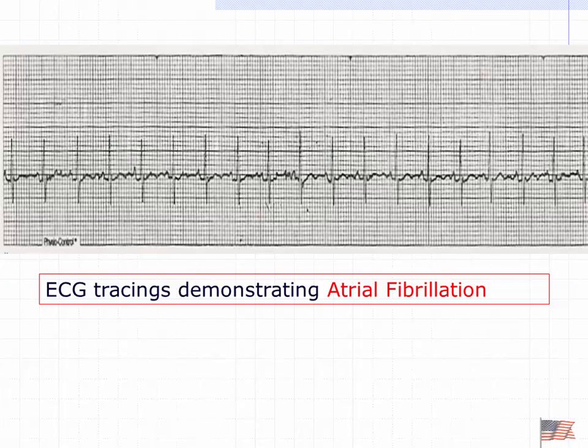Another example of atrial fib. Can't make out a nice clear baseline. Okay? And it's not sawtoothed, so I know it's not atrial flutter. This happens to be a very well-controlled atrial fib. Usually the R to R is not that nice. Why is the QRS wave really high, like peaking up? It's very narrow, meaning that it's within the range of what we would normally expect. It just looks bigger because the P wave isn't there. Would you say they're tachycardic too? Oh yeah, absolutely they are. And atrial fib often is.